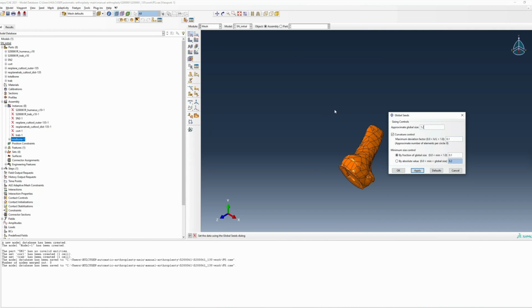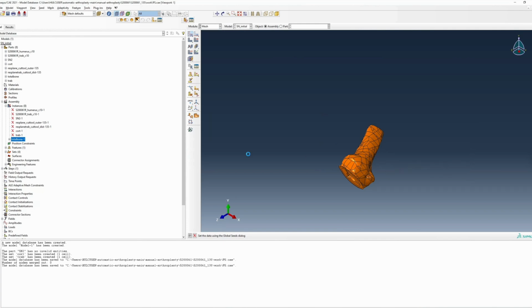Here you can see I'm using a global seed size of 1.2 millimeters with curvature control of 0.05 and minimum size control of 0.01. These values are very specific to my analysis, so ensure that you do the proper research in order to understand what settings are required for yours.